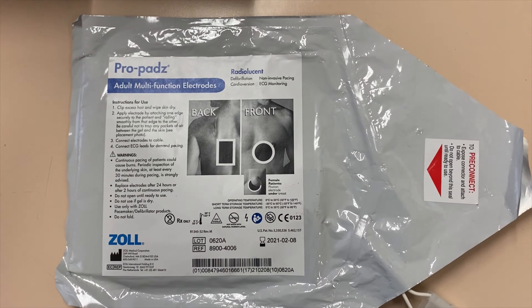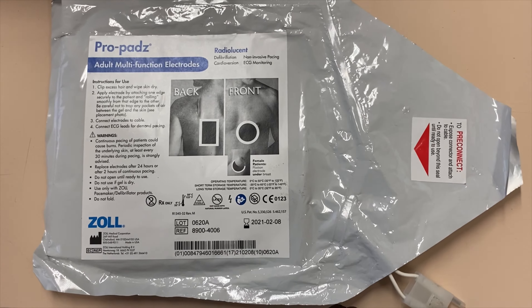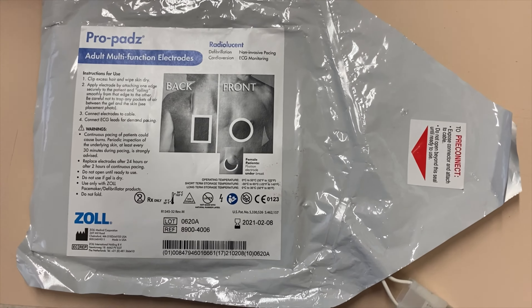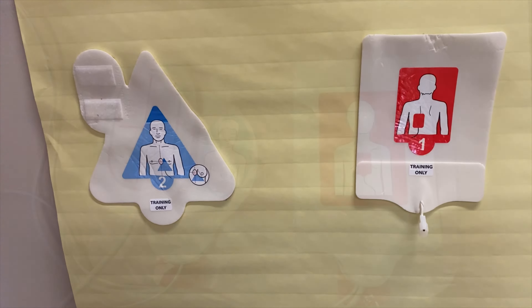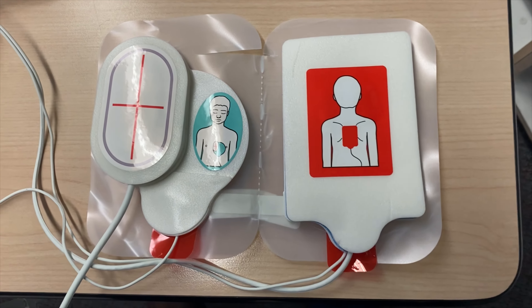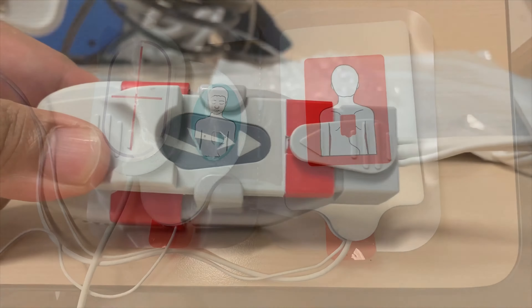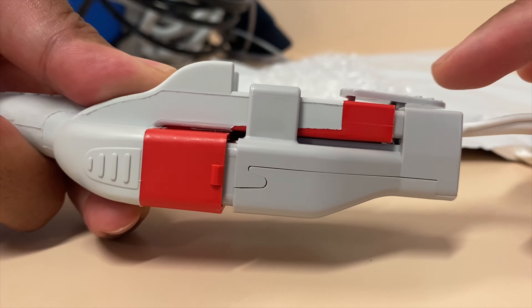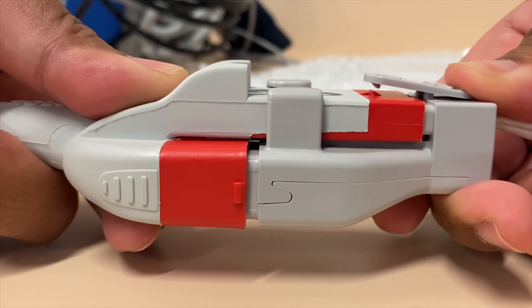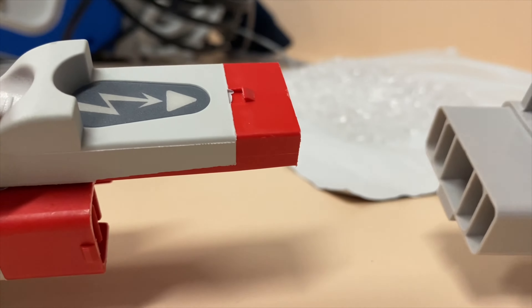There is also a multifunction electrode pad that you can use for cardioversion. That entails placing this anterior and posterior — that means front and back. Once you open that pad, this is how the pads will look. This is how a pediatric pad will look like. The recommended placement will be anterior-posterior. To remove this pad, you want to make sure you're pressing on this area here, so that it releases from the other part of your connector — press and pull.